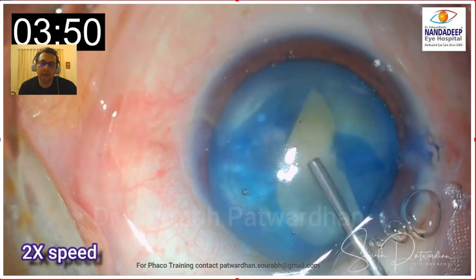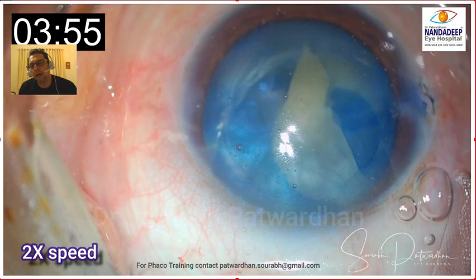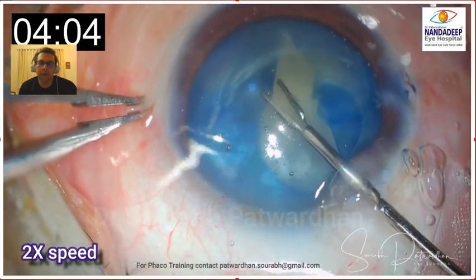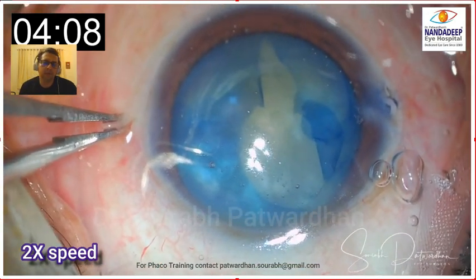These are the mistakes which happened during the course — right from starting with a very large first flap extending into the periphery, and then not doing the decompression of the intralenticular pressure, which is not a good thing in such cases because you are going to get the Argentinian flag sign. So I think we all saw the case and how it was approached and how we can approach it differently for a better outcome. Intumescent cataracts have to be planned: you can use a cruciate puncture and aspirate from the side ports using a 27-gauge cannula connected to aspiration tubing or a syringe, or you can do a small two-stage capsulorhexis — a tiny capsulorhexis first, then aspirate the fluid, and then enlarge.